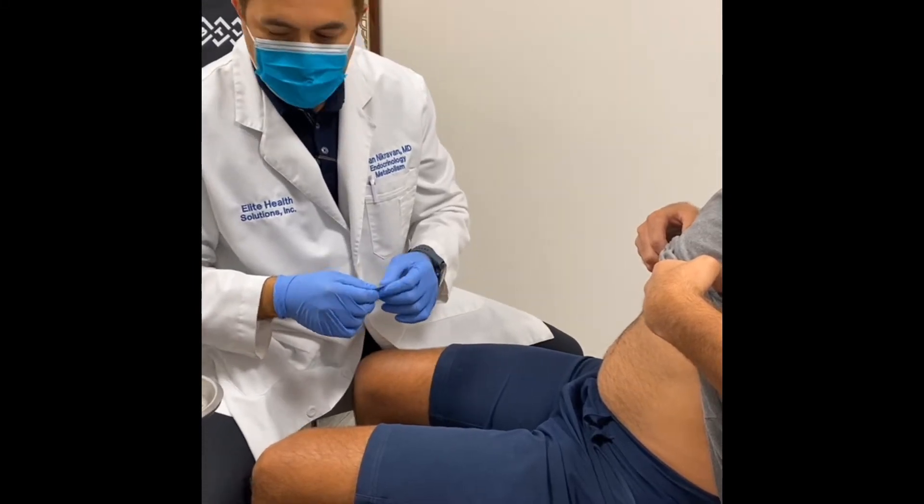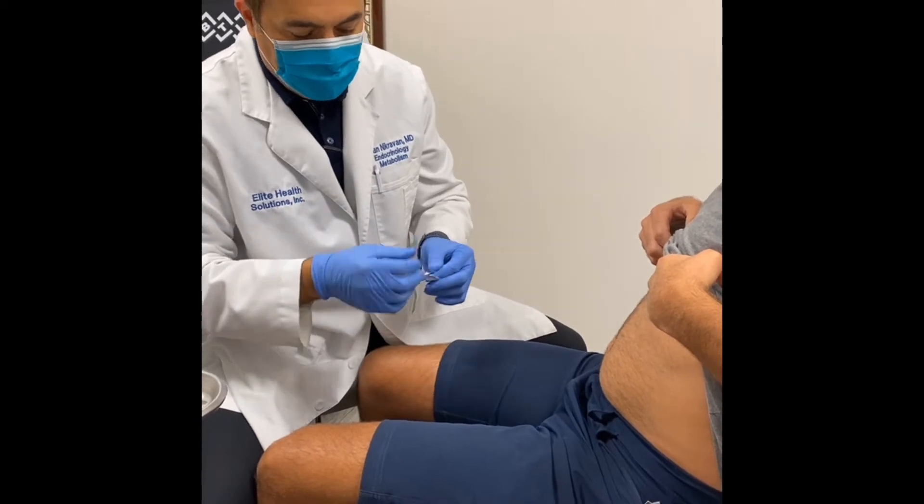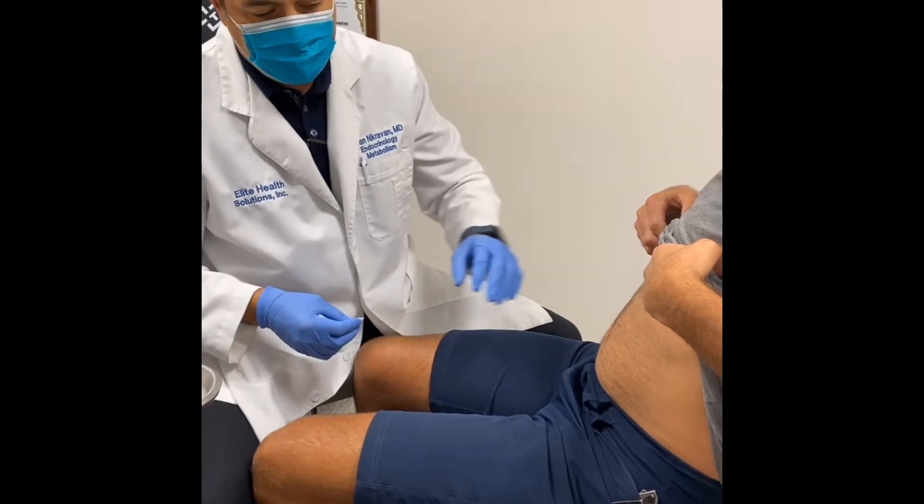Hey guys, this is Dr. Nick Ravanna. Many of you have asked me about testosterone modalities of therapy. I'm going to demonstrate this — a nice patient has allowed us to video him regarding a testosterone injection.